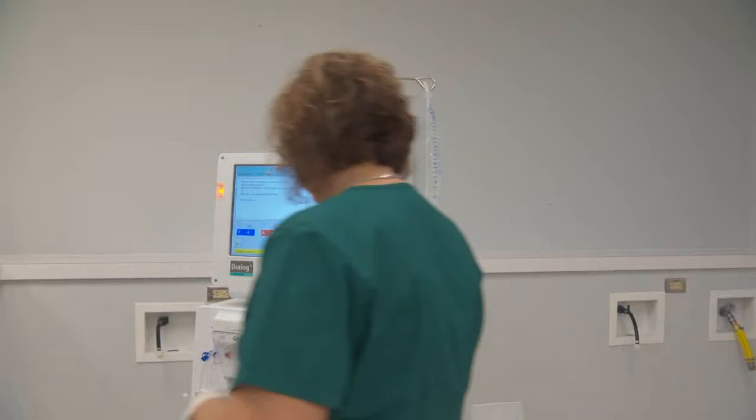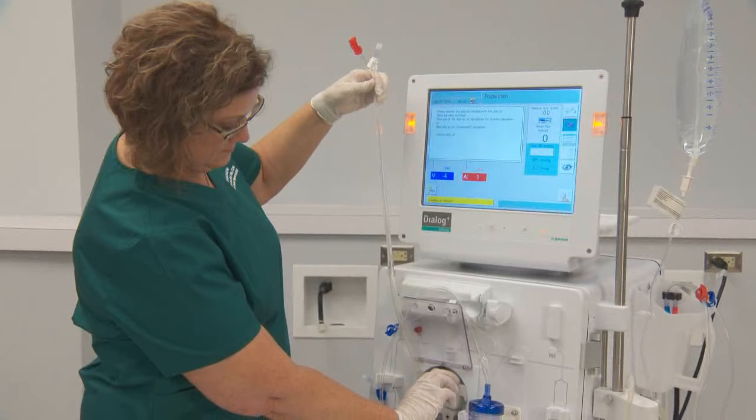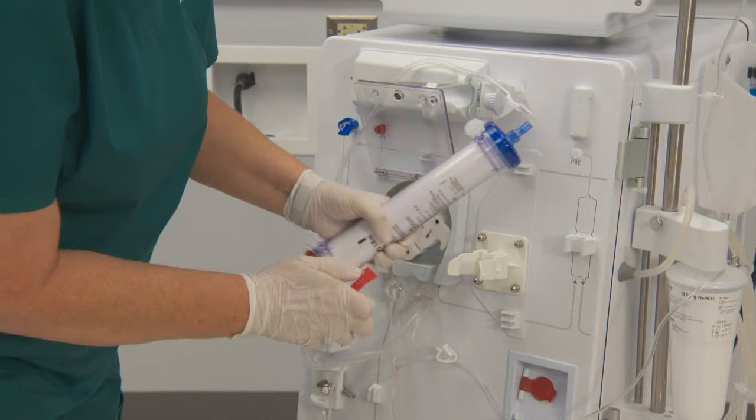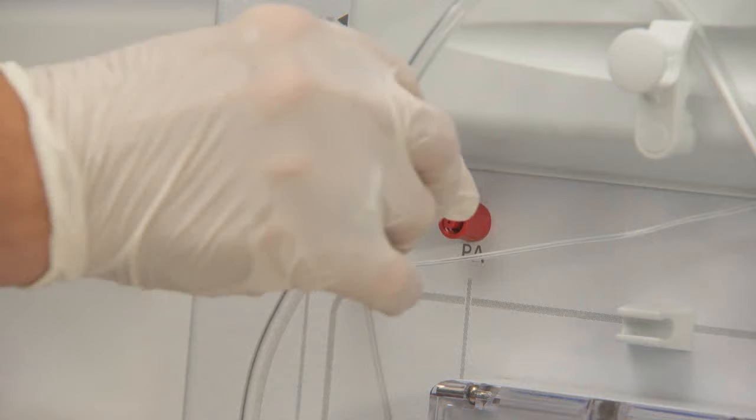Hold the dialyser end of the arterial line up as straight as possible. Open the upper clamp on the infusion line and allow the arterial line to prime by gravity. Once air is purged, load the blood pump segment by hand to stop the flow of saline. Connect the dialyser end of the arterial bloodline to the dialyser. Close the blood pump cover and connect the arterial pressure pod to the arterial transducer.